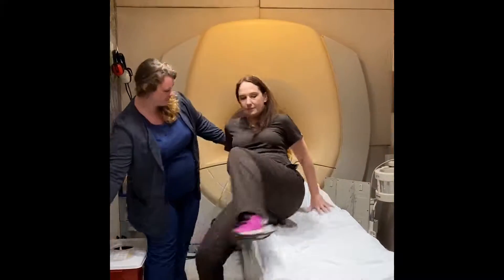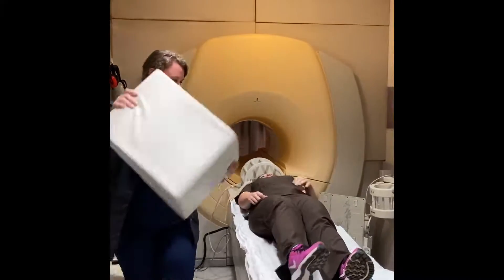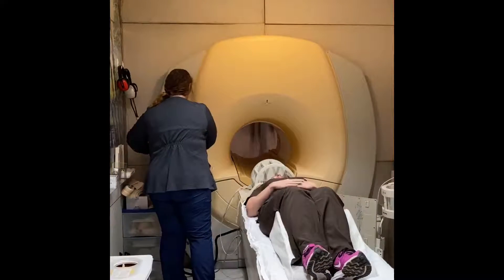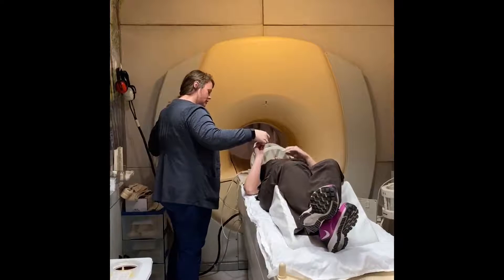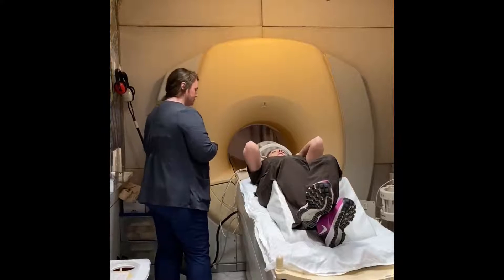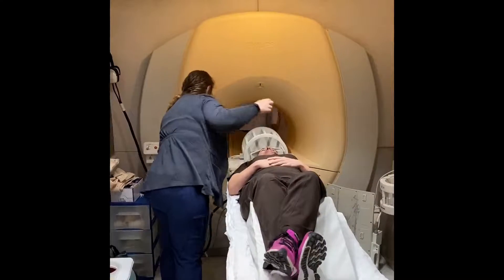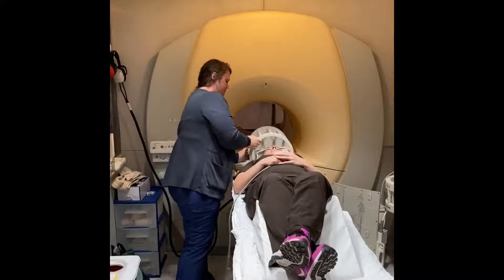Once you have been cleared to enter the MRI suite you will be positioned on the MRI table for your test. A plastic coil that acts as an antenna bringing signal to the area of interest will be placed around your head. Earplugs will be given to prevent any ear damage from the loud noises the MRI scanner produces. Sometimes cushions are used to help hold the head still. You will be given instructions to hold very still throughout your test as motion can interfere with image quality.